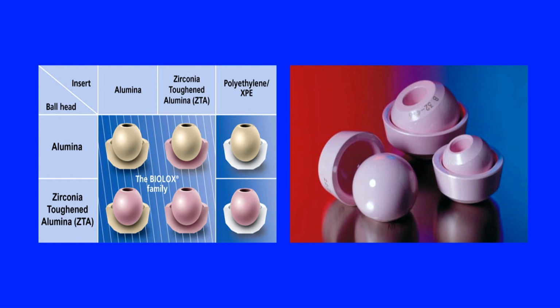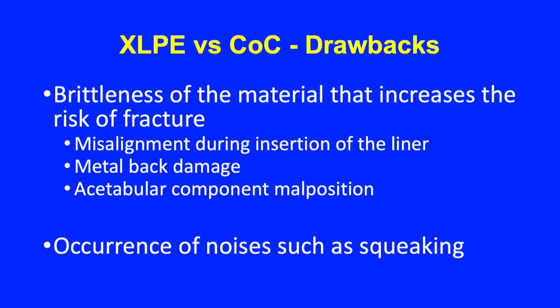You have different kinds of material in the evolution of ceramic on ceramic, and then definitely a different head size, different taper on the head and different taper on the socket size to prevent the complications. So you have all the things which have been addressed in a newer design, and which can be used definitely.